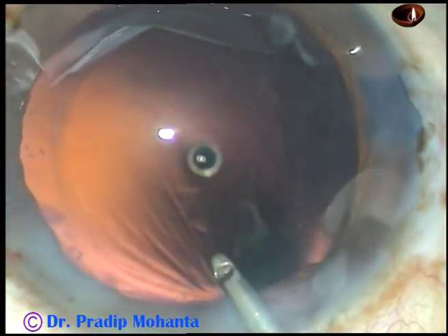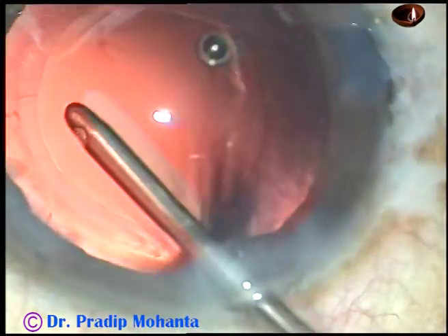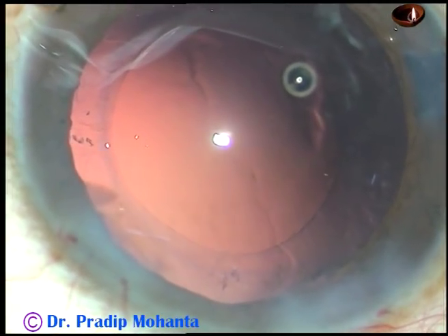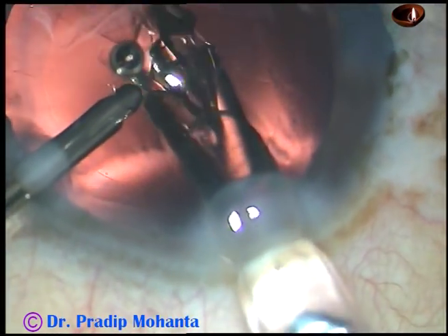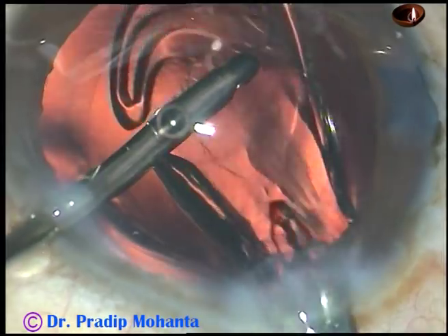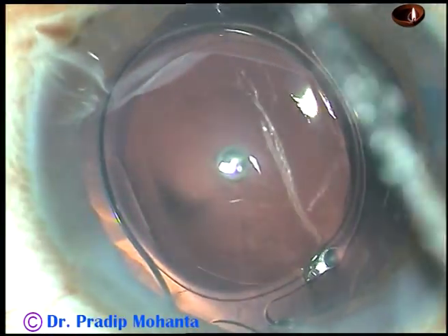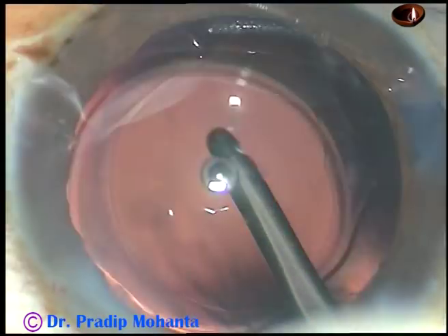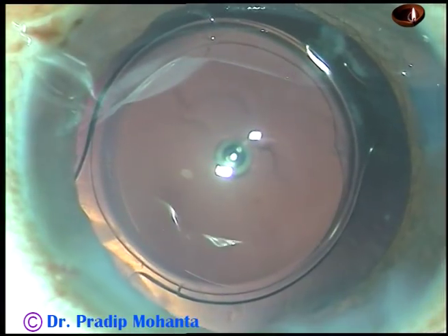And now this is hydro polish. A foldable intraocular lens is being implanted keeping the anterior chamber formed by irrigation — we can call it hydro implantation. The lens has gone into the capsular bag. See the size of the rhexis — the rhexis has covered the optic all around, and we call it ideal rhexis.